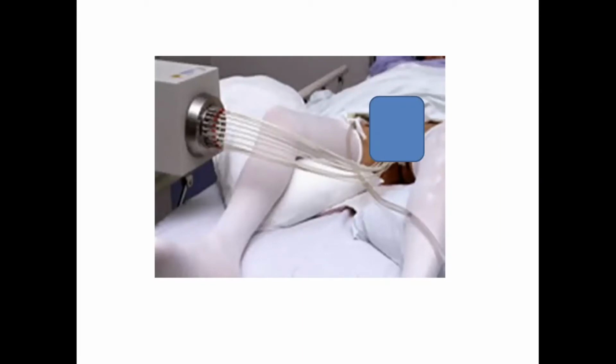So this is what it looks like when the patient finally gets to the cancer centre for the brachytherapy treatment. So they've woken up from their anaesthetic. They've had a CT scan and an MRI scan. And myself and the physics team have done all the voluming and planning together. So I draw on the area that needs treatment, and I draw on the urethra and the rectum to say that doesn't need treatment, thanks very much. And then the physics team come up with a plan about where the radioactive source needs to loiter in the prostate, in those plastic tubes, and for how long.